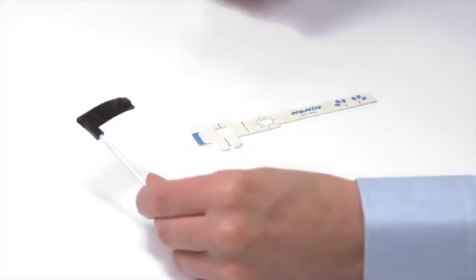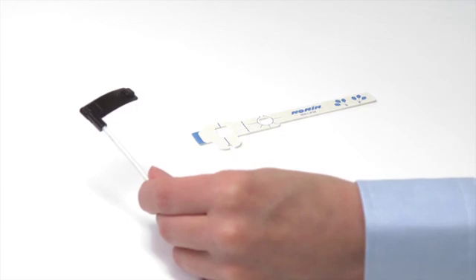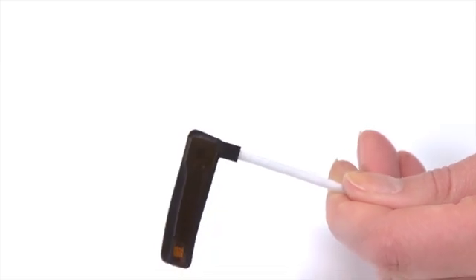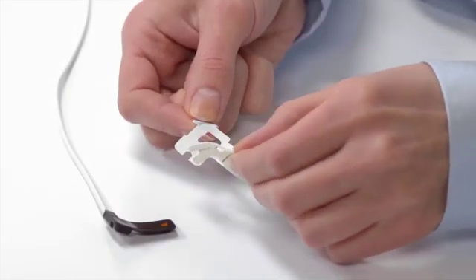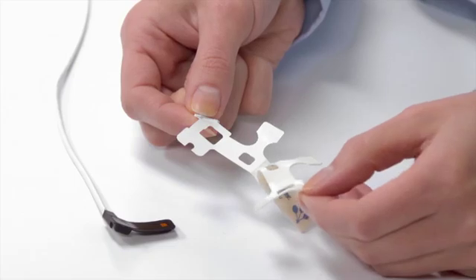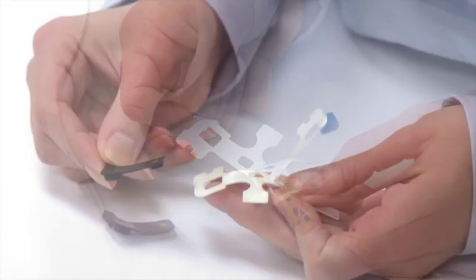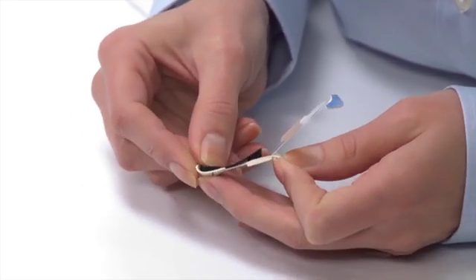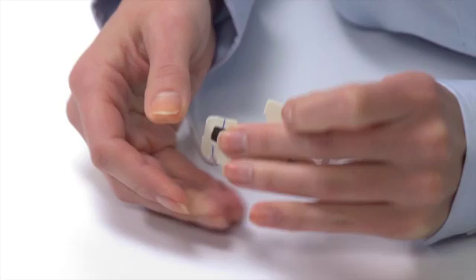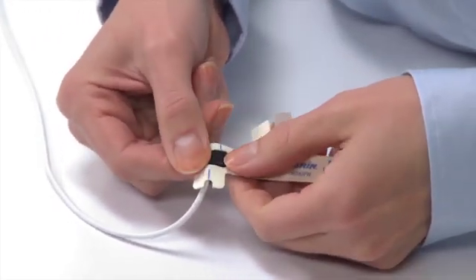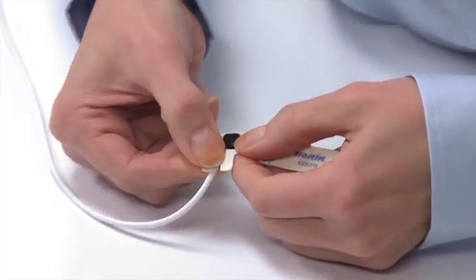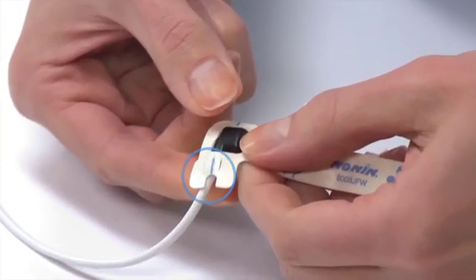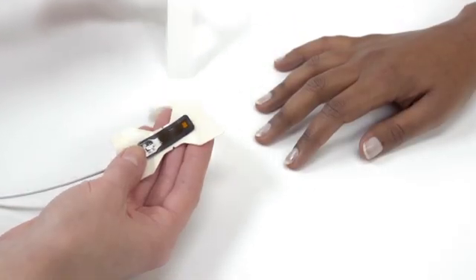Place the flex sensor and a new FlexiWrap on a clean work surface. Make sure the sensor is clean and free from adhesive or debris from previous use. Partially peel back the adhesive backing tab on the FlexiWrap so the sensor area adhesive is exposed. Align the sensor emitter and detector skin contacting side up to fit in the cutouts on the wrap. Then gently press the sensor into place on the wrap. The cable should extend beyond the wrap supported by the adhesive and tab on the wrap. Remove the adhesive backing from the rest of the wrap.